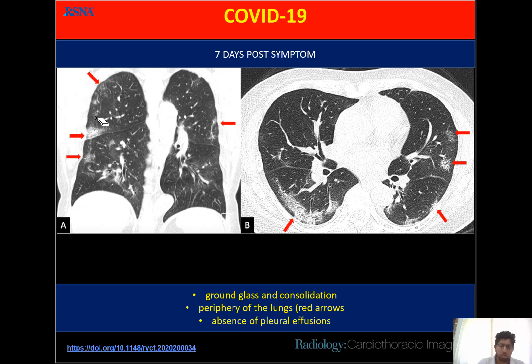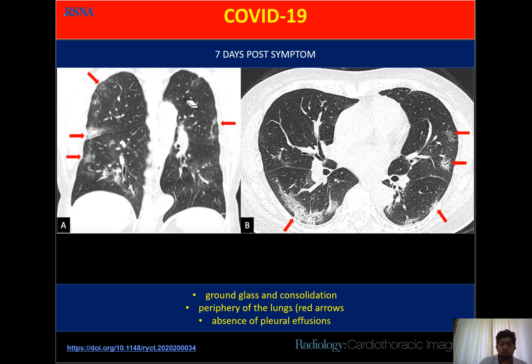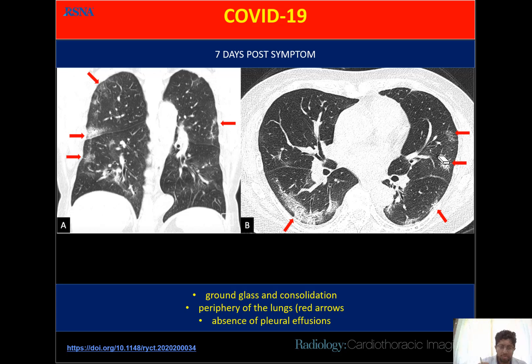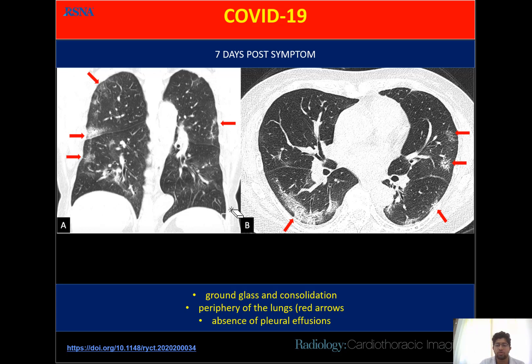The most common feature seen in COVID-19 is ground glass opacity — present in 86% of cases. Consolidation is seen in about 60% of cases. Distribution is peripheral, with bilateral lung involvement and lower zone predominance. There is no fluid in the pleural space confirming absence of pleural effusion, absence of mediastinal lymphadenopathy, and absence of pericardial effusion. Ground glass opacity or consolidation with bilateral lower zone peripheral distribution — this is the CT finding of COVID-19.